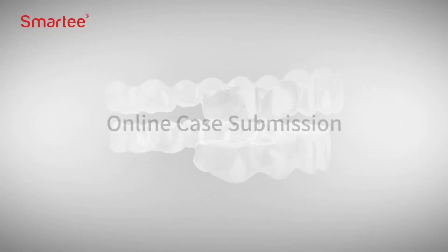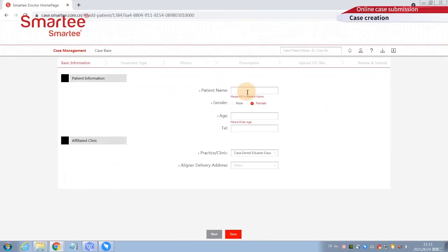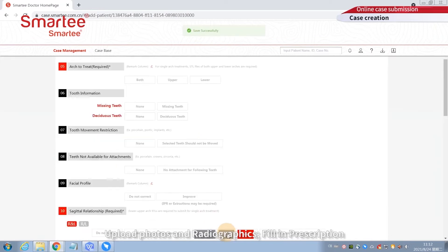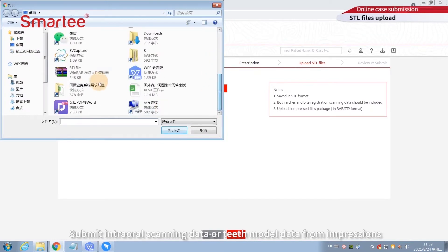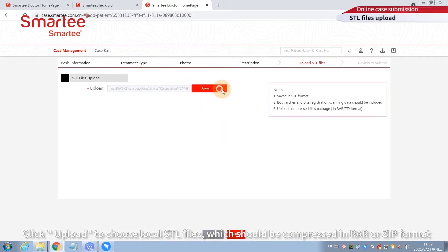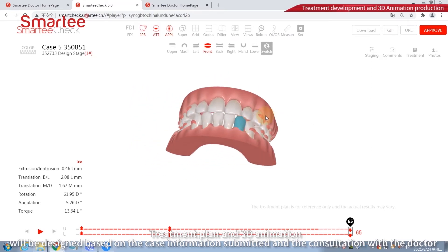For online case submission, log in and follow the link for case creation. Follow the instructions step-by-step: fill in the basic information, treatment type, upload photos and radiographics, fill in the prescription, and submit intraoral scanning data or teeth model data from impressions as STL files compressed in RAR or ZIP format.